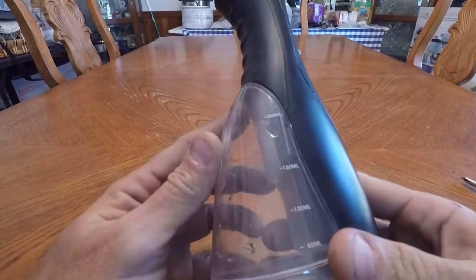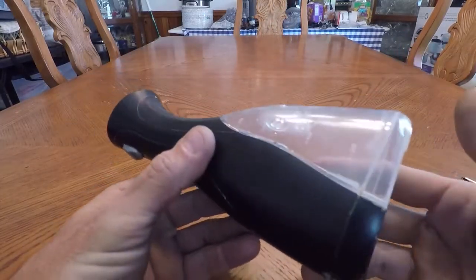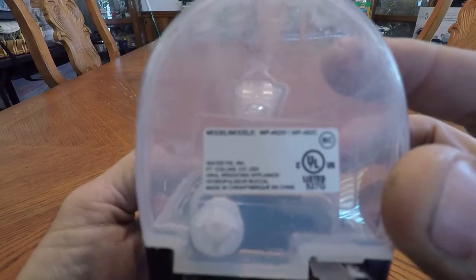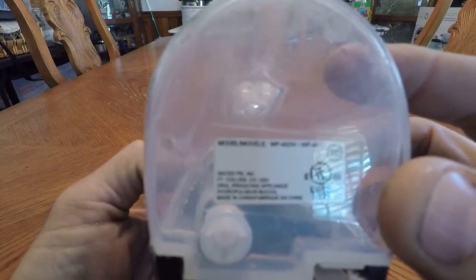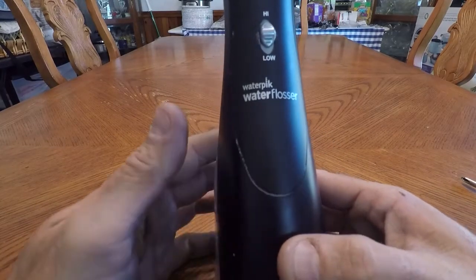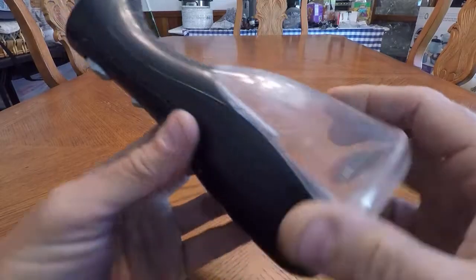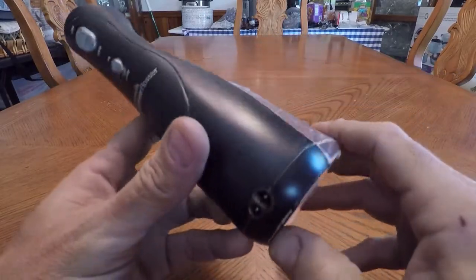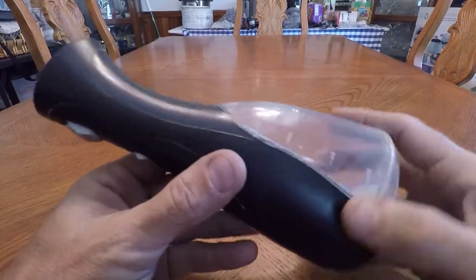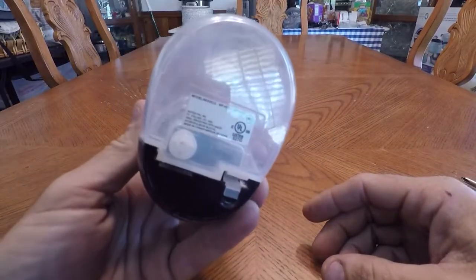This is my Waterpik Water Flosser. I've had it for maybe two years. The model number is WP-462W or WP-462C. It works really well — I use it once a day, and I believe it has helped make my dental appointments less annoying. But the battery seems to be getting a little weak. It wasn't terribly expensive, but it wasn't free, and I don't feel like buying another one. So I'm going to see if I can figure out how it comes apart and find a battery we might be able to change.